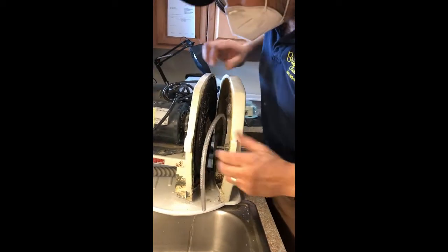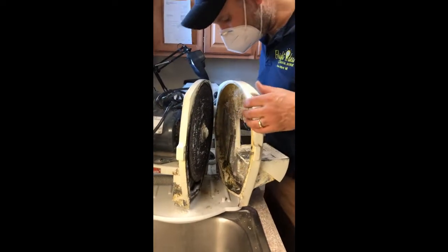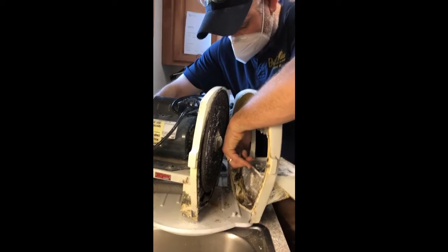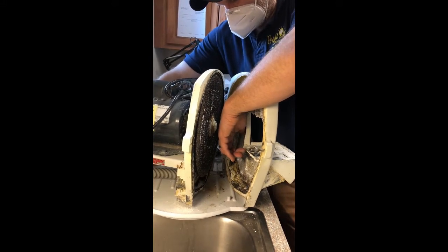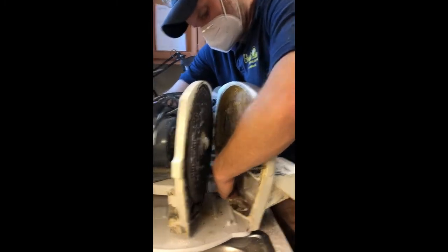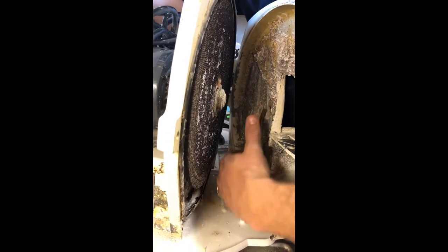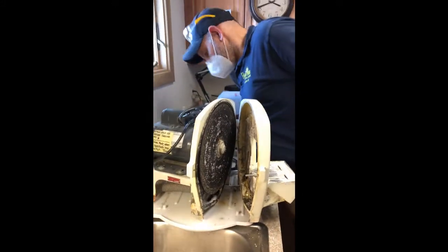Well, the water's not really flowing like we'd expect, so we might still have some sort of a clog going on. Let's see what we have here. Okay, so the water's only making it up to... okay. So we appear to have some sort of water flow issue, or maybe the water's just not flowing enough.